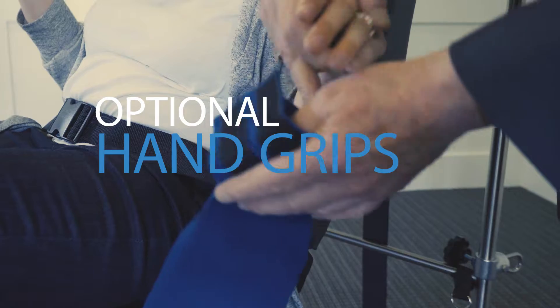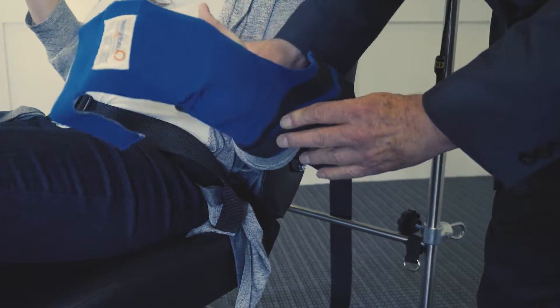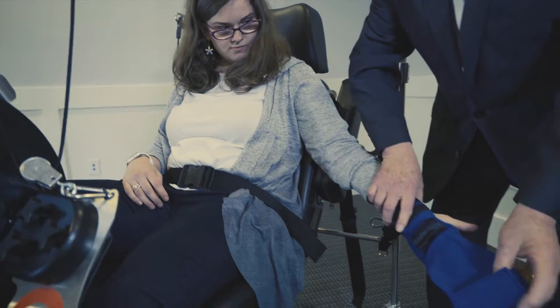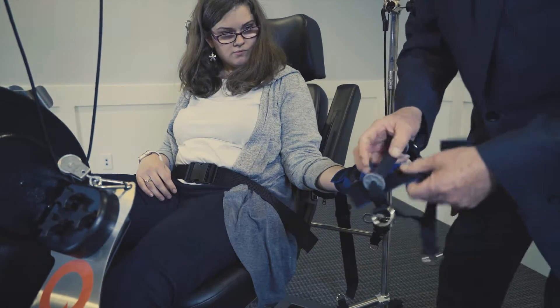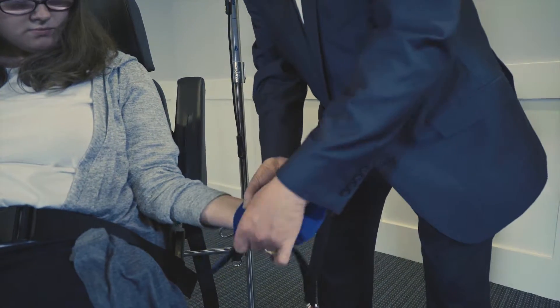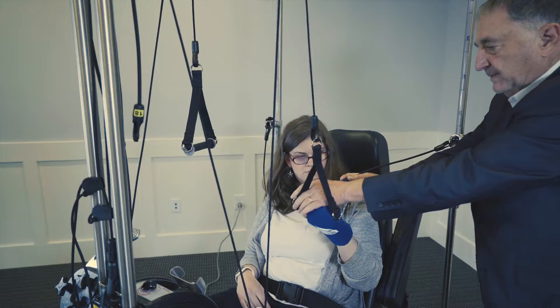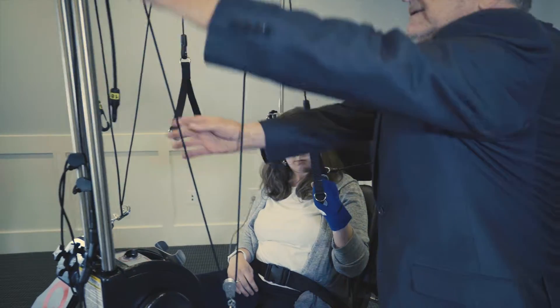Now we're going to put this glove on. It's like a mitten, so you keep your thumb out. So now we have this in place. We put the hand grip in. You need more space for the thumb. And this wraps around the wrist. This is very important because we're lining everything up the way it naturally should be.